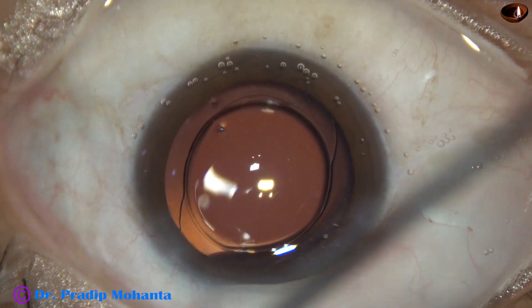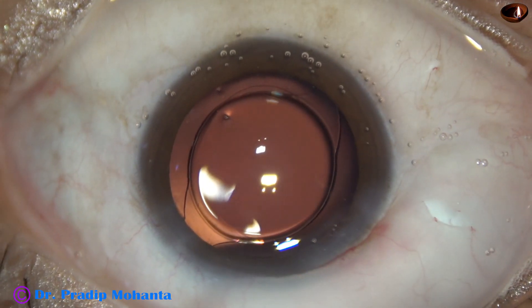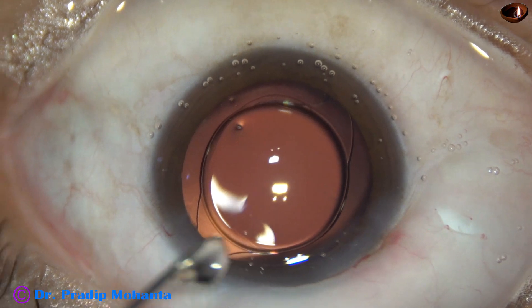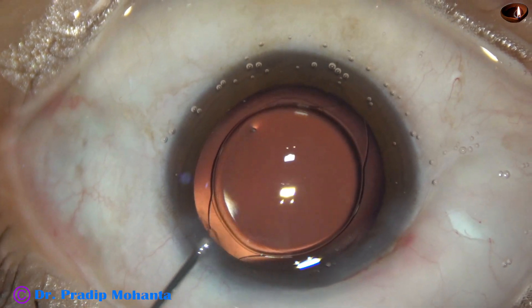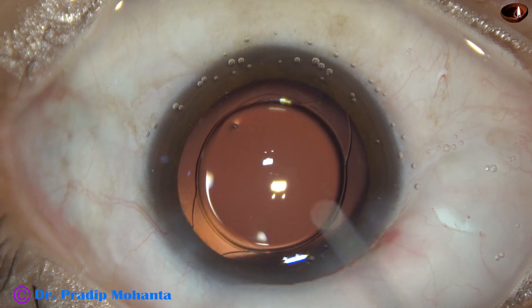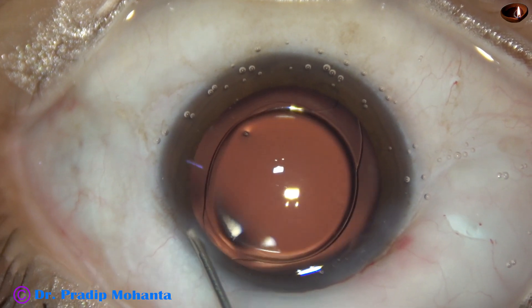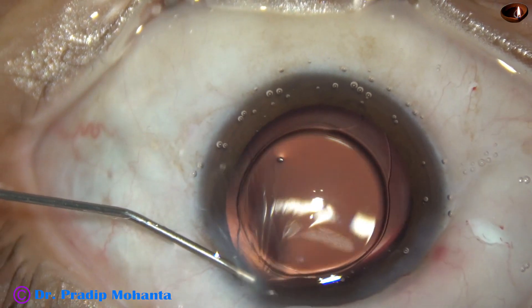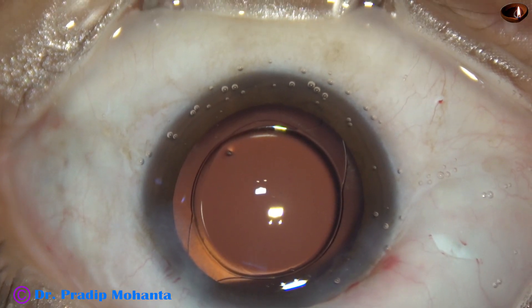I made some punctures on the conjunctiva to reduce the chemosis fast, because the eye will not be patched — the eye will remain open after this surgery. The patient is under topical anesthesia, as I mentioned before.